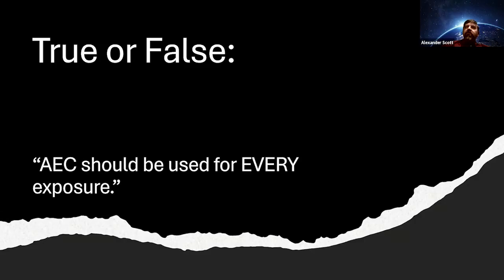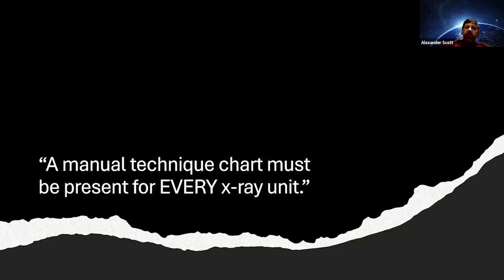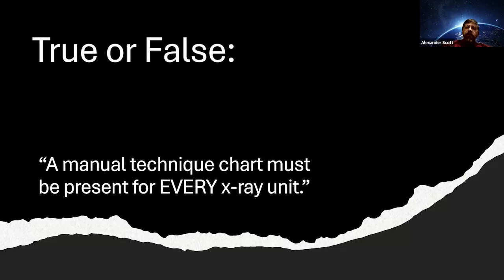But what those individuals didn't realize is that the technology was advancing. So they knew the right manual technique for the old technology, but as we were paying a few $100,000 for something new, it was able to use less radiation for the same quality. So using the AEC was helpful to the patient.